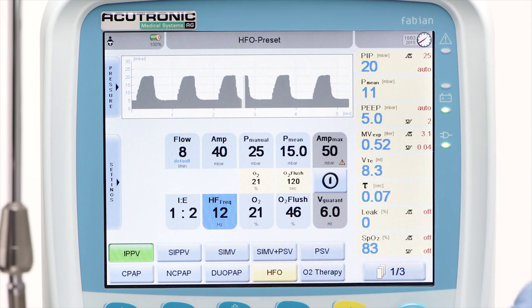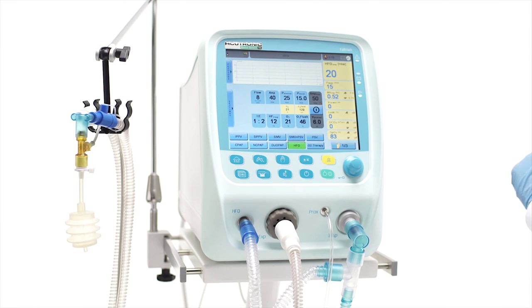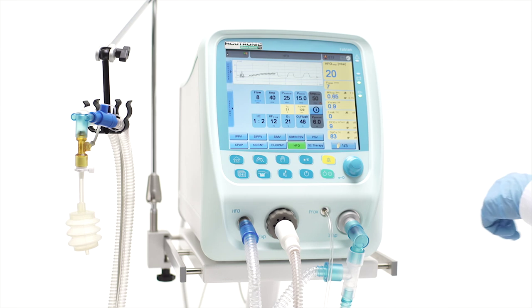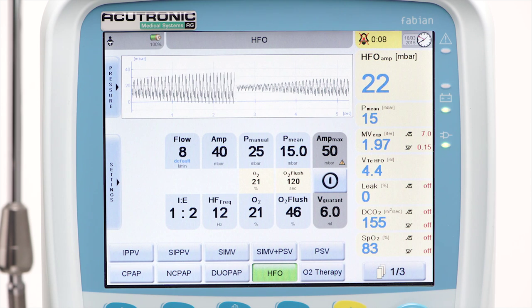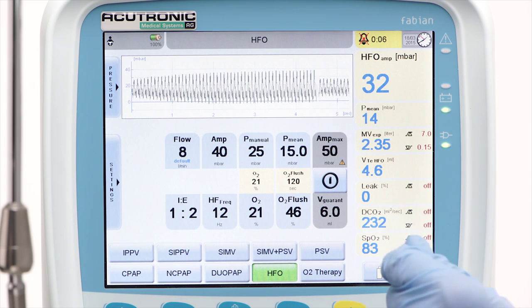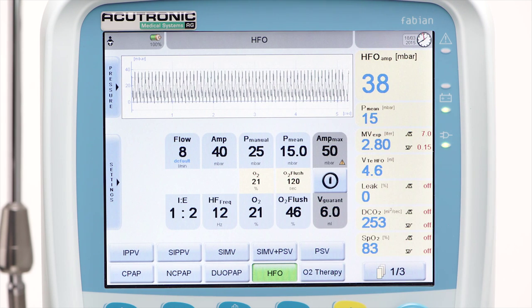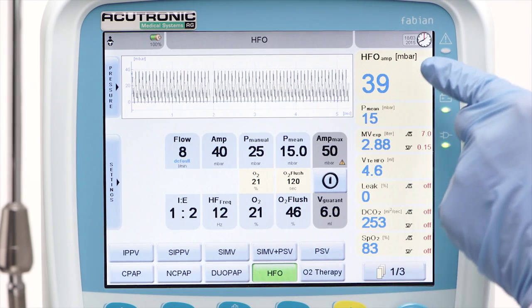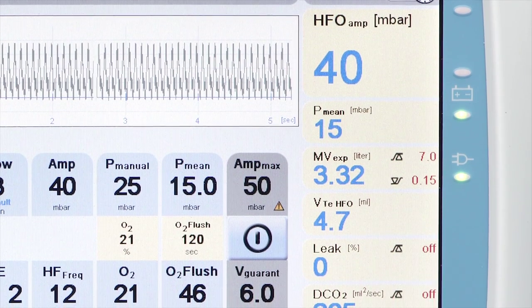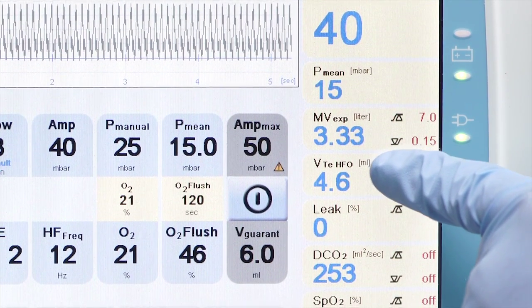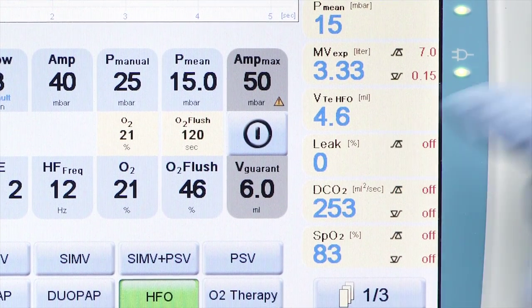In HFO mode, a target tidal volume can be set for volume guarantee. Based on the tidal volumes measured by the flow sensor, the oscillatory amplitude is adjusted automatically to reach the target tidal volume. The Fabian HFO will oscillate the patient with the set values corresponding to the real values displayed on the measured value screen. In addition, other important parameters are measured and displayed, like tidal volume in HFO, the leakage measured at the ET tube, the DCO2 parameter, and SpO2 values if the SpO2 optional module is active.